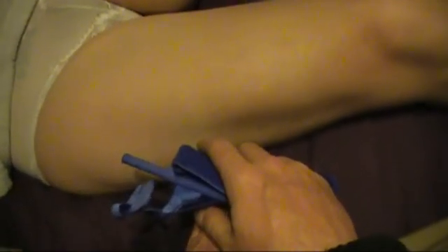Now, some people are like, well, I can just use my belt. Okay, well, belts are cute and all, but try twisting a windlass on a belt, okay? It doesn't happen, okay? It's too wide. It's too heavy. And now you can use rope, but the problem with rope is, it's really going to cut in there, okay? And if you're using skinny rope, it'll actually cut the flesh before it even occludes off the blood vessel.